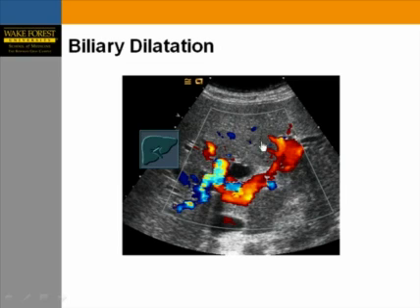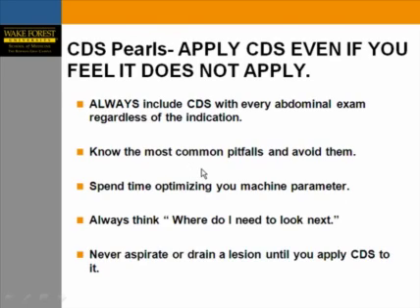For biliary dilatation, apply color Doppler — any cystic structure not filling with color that follows an anatomic course is most likely a bile duct.